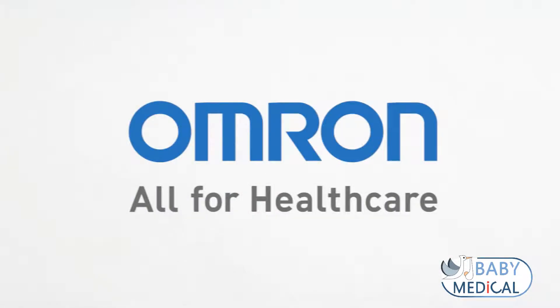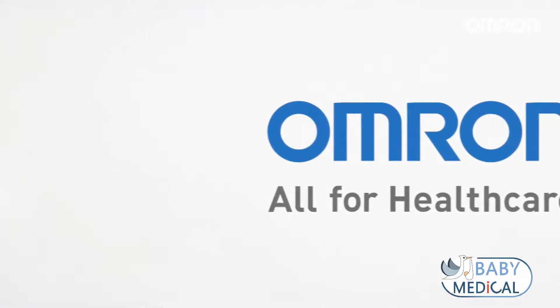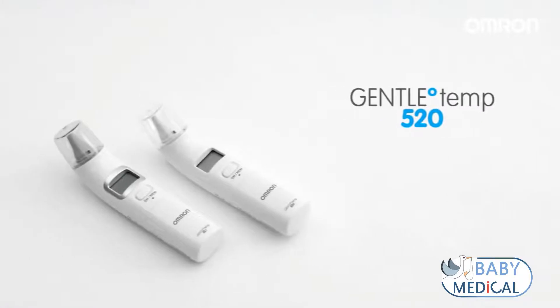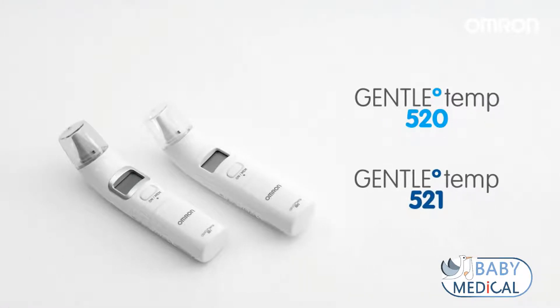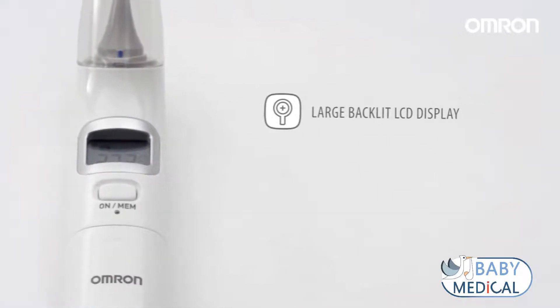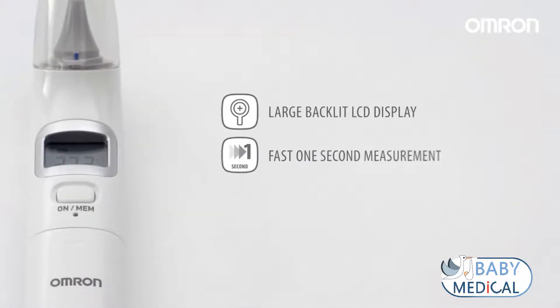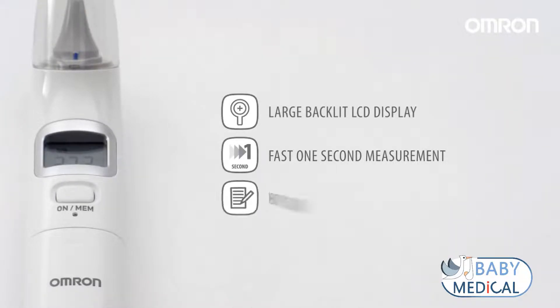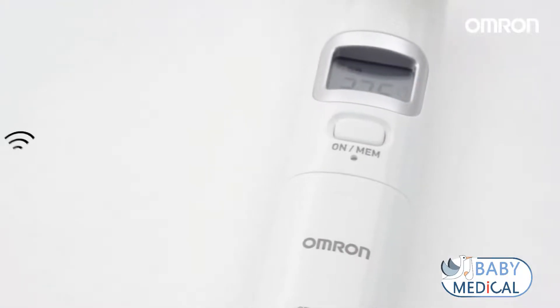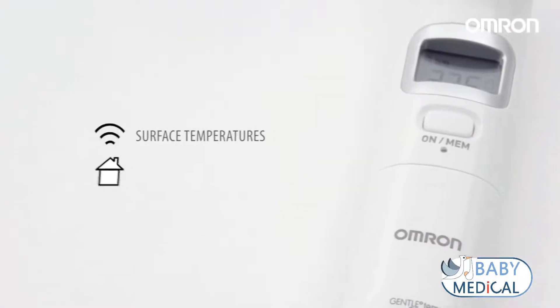Omron Healthcare is introducing a new range of fast, ergonomic design digital ear thermometers, the Gentle Temp 520 and Gentle Temp 521. The range of sophisticated features includes a large backlit LCD display, fast one-second measurement in either degrees centigrade or Fahrenheit, and memory for 25 readings. For extra flexibility, the Gentle Temp 521 ear thermometer offers three-in-one temperature measurement for surface temperatures as well as room temperature.